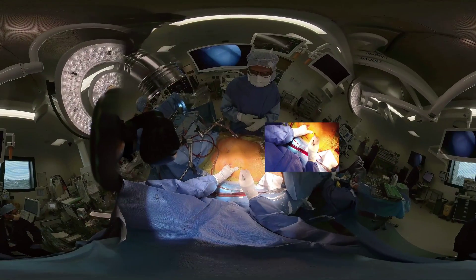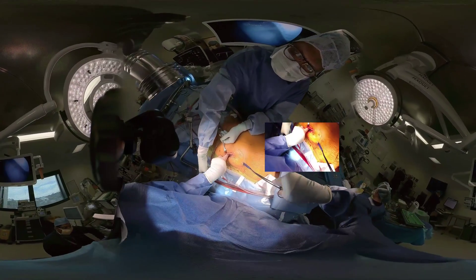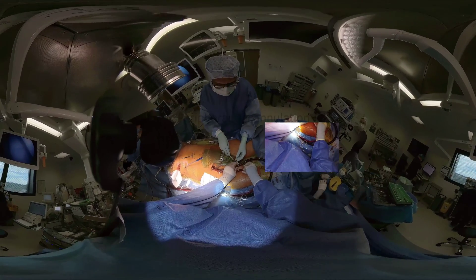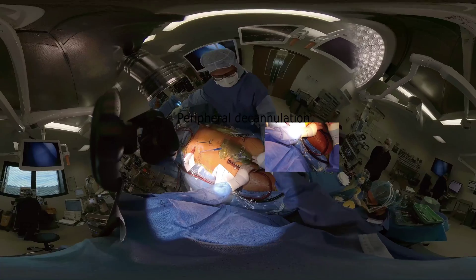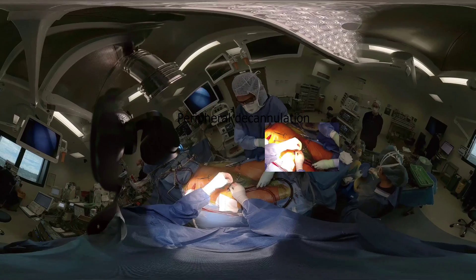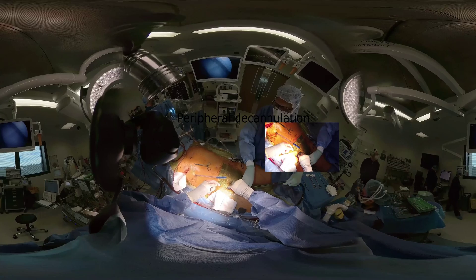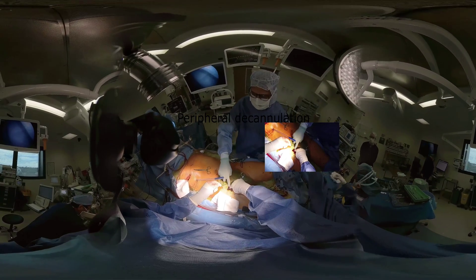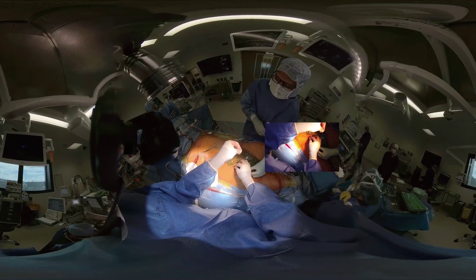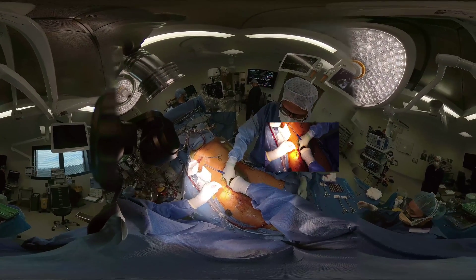The pericardium is then approximated with interrupted sutures to facilitate future redo procedures. A drain is placed one or two intercostal spaces below the minithoracotomy, which is then closed using pericostal sutures. Femoral decannulation should only be done once the patient is stable, as trying to recannulate the vessels may be difficult and carry potential complications. The purse strings are then knotted and sometimes an extra hemostatic suture is placed. The groin and the minithoracotomy wounds are then closed in layers.